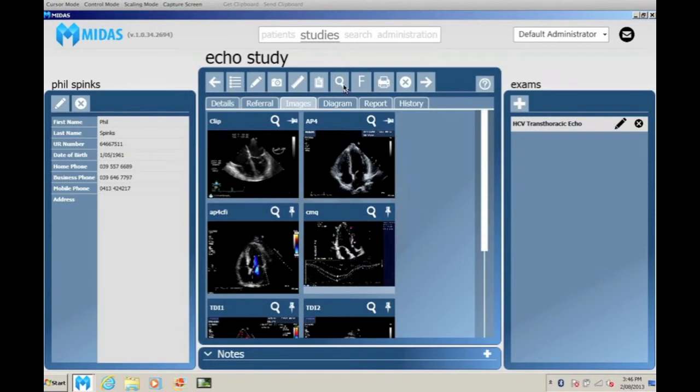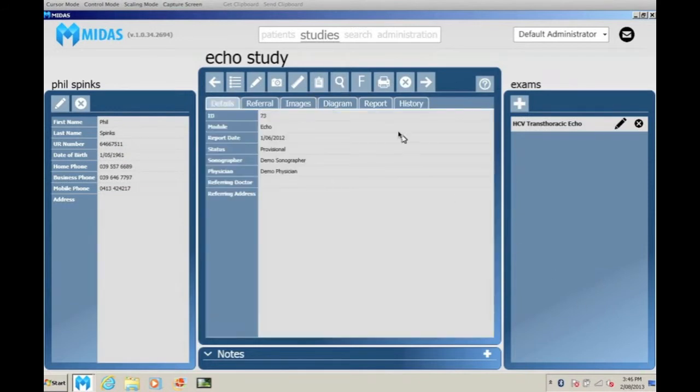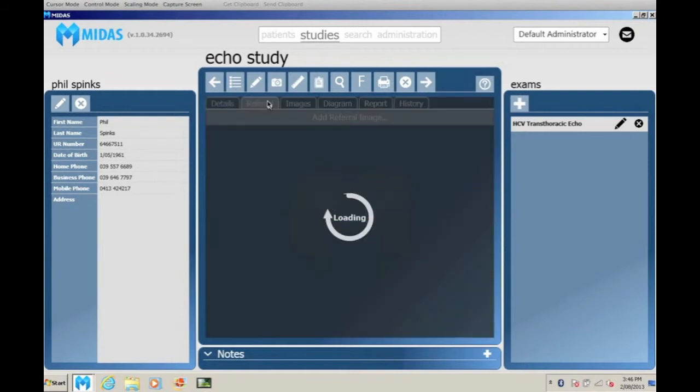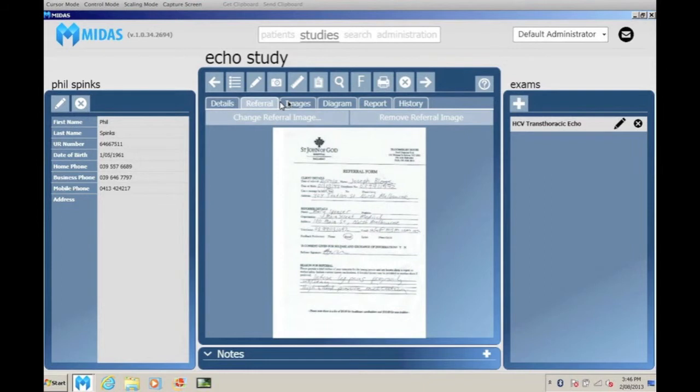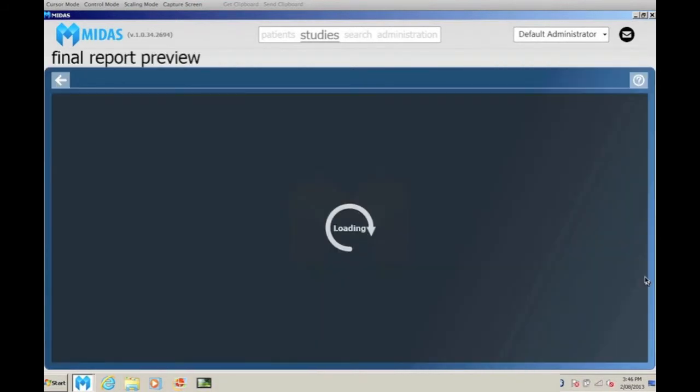The preliminary final file can be accessed by the reporting clinician to modify and verify then authorize the final report complete with electronic signature, diagrams and images on the practice letterhead.